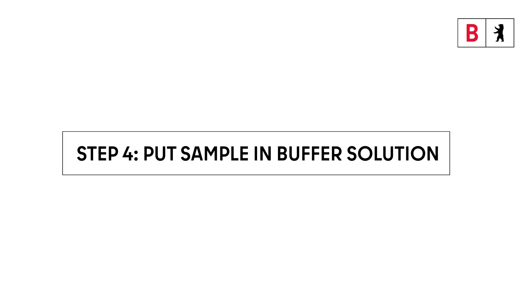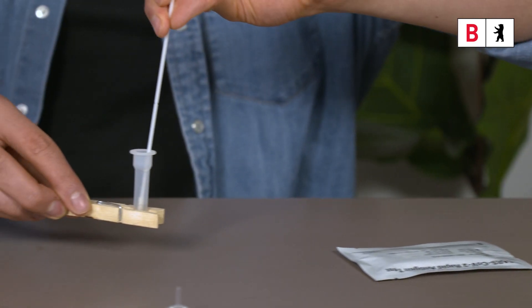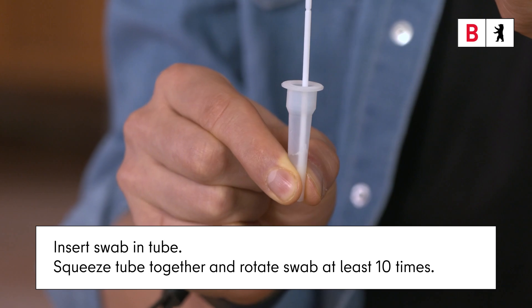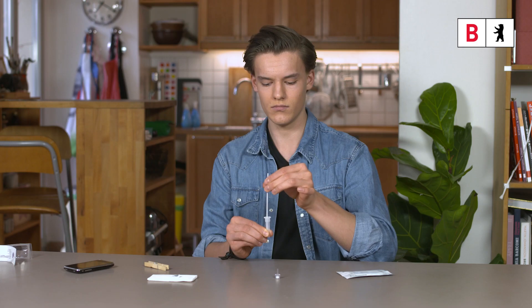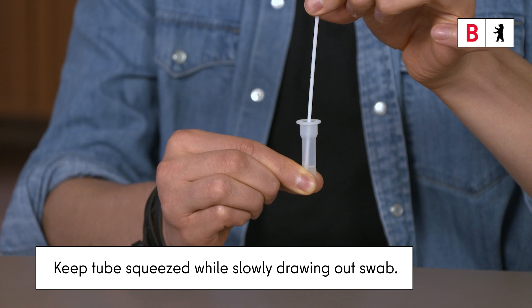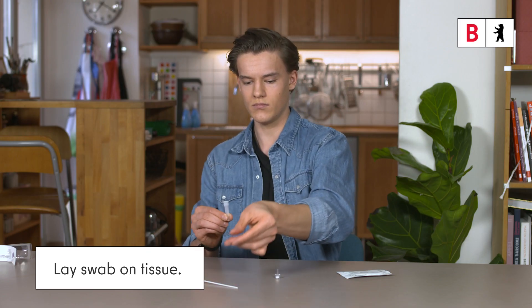Step 4. Put the sample in the buffer solution. Insert the swab into the prepared tube. Squeeze the bottom of the tube together and turn the swab at least 10 times. Then keep the tube squeezed together and slowly draw out the swab. Lay the swab on the tissue.